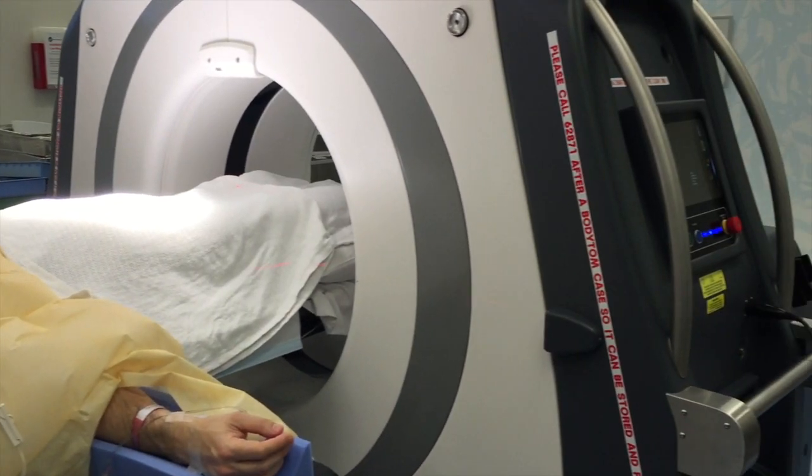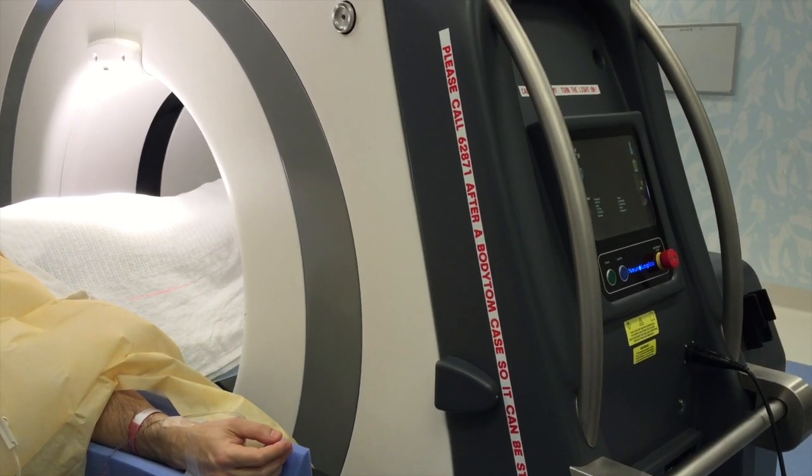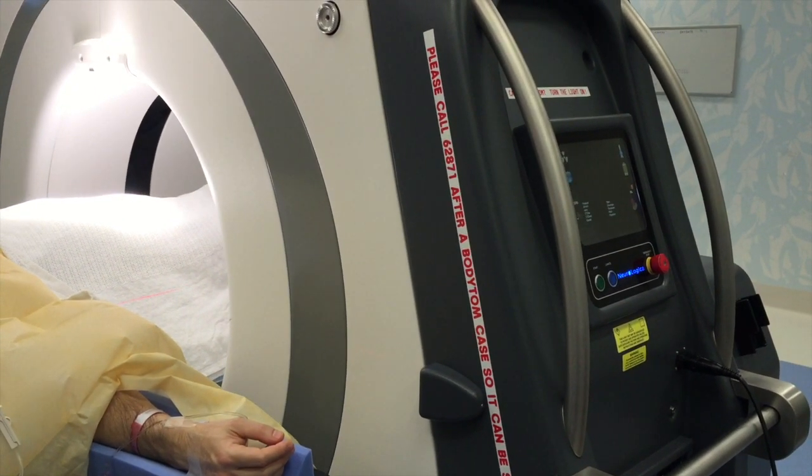Both of these were placed at the same time through a small incision in the lower part of the abdomen. In this procedure I used our intraoperative CT scanner to confirm the appropriate location of the devices prior to the patient leaving the operating room.